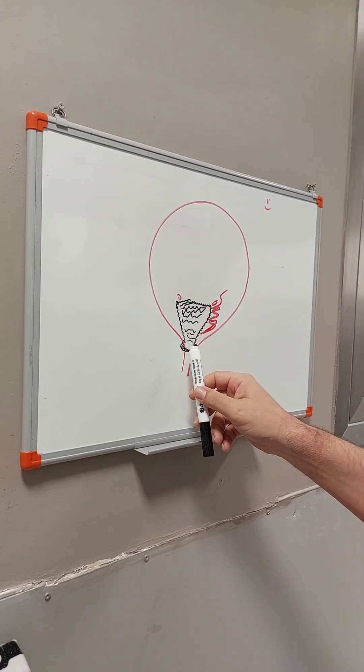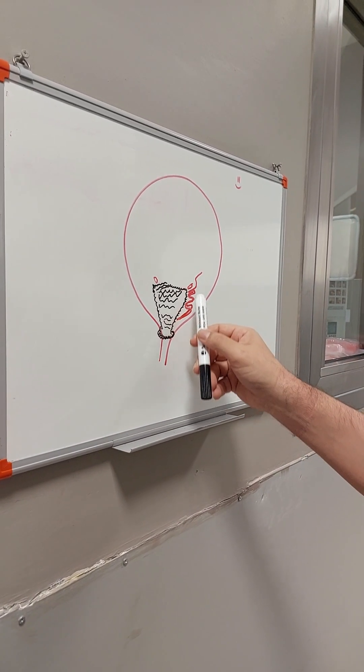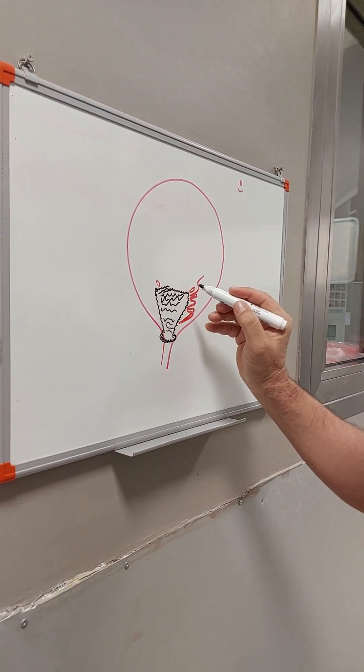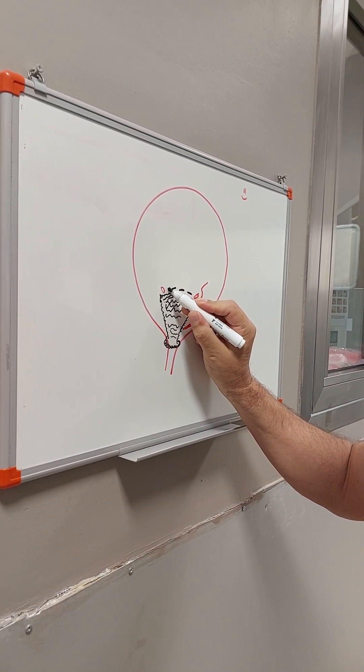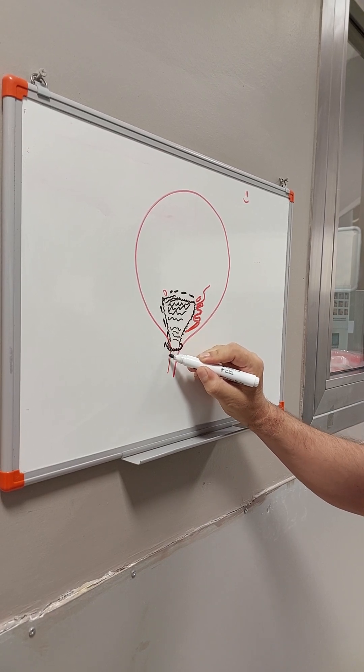We go inside with the rigid instrument again. It's very hard to define the borders for the lesion. So we make some borders — we mark the borders of the lesion, all the parts.